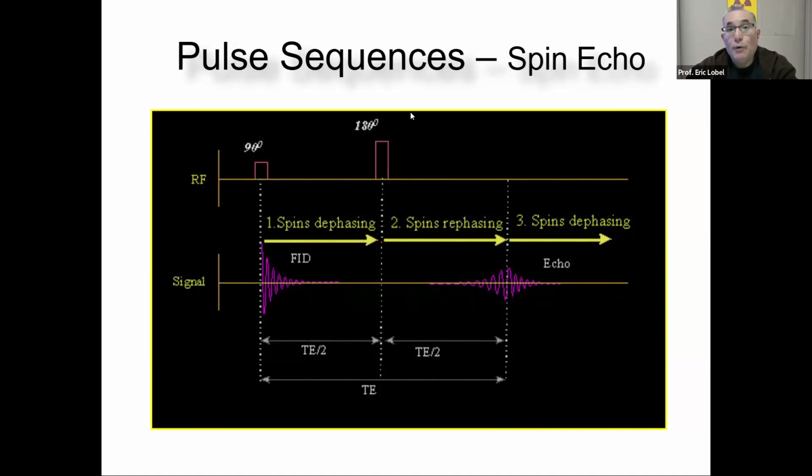What fixes it momentarily is this 180-degree kind of reversing effect. And what that will do is it kind of snaps everything back together. We'll go over it again.